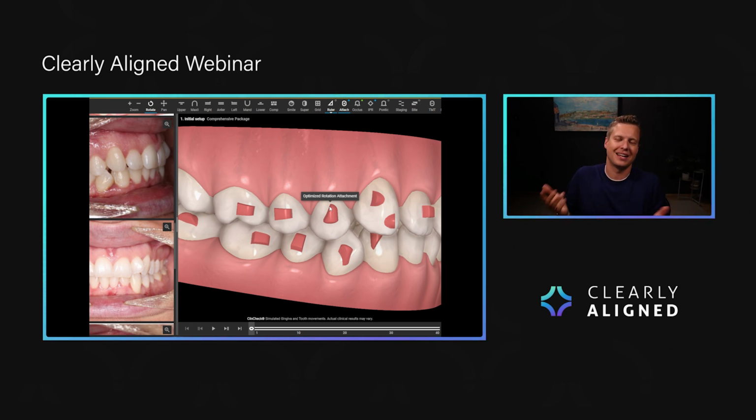If you take that ClinCheck and you use it, they're gonna set up the teeth with a ton of IPR on the lower, because they're saying, hey, they got this giant open bite in the back. Well, no, it's just my patient was shifting their jaw. And so when they're doing the scan, it's all in the wrong spot. In that case, because we caught it before the patient left, we just told the assistant rescan.